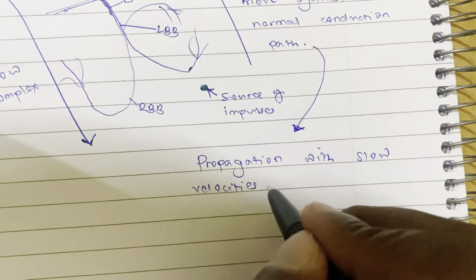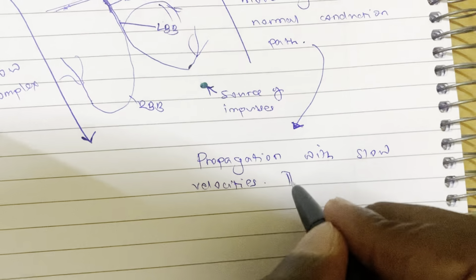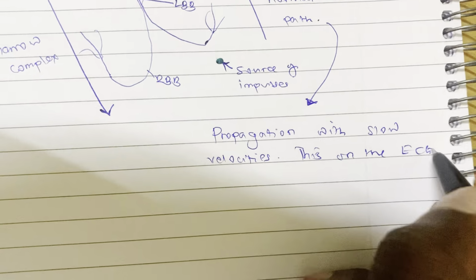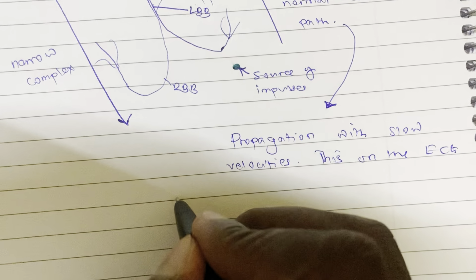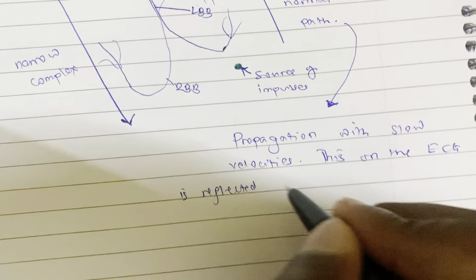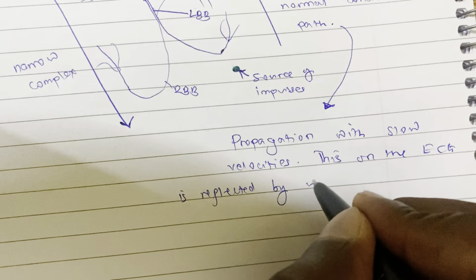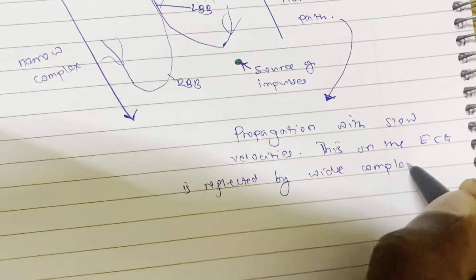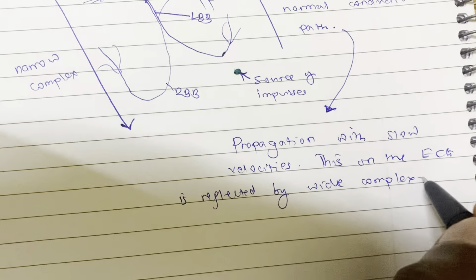This on the ECG is reflected by wide complexes.